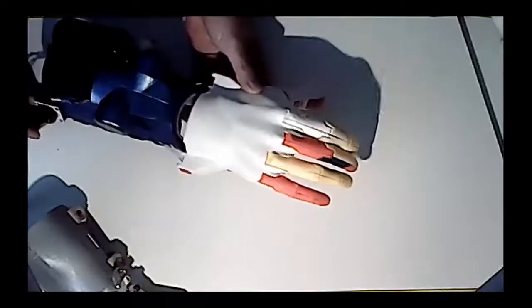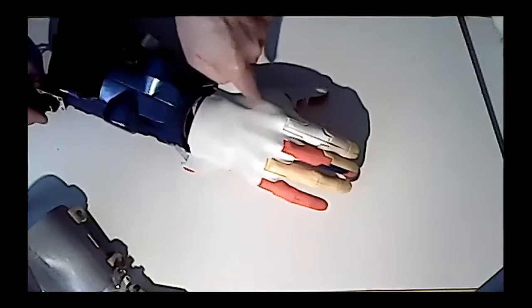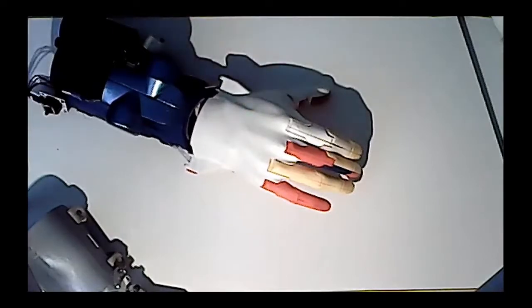So here we try to be better than the myoelectric sensors. Somebody has a very good idea to insert here a micro joystick. The micro joystick you may have in a PlayStation or in a handle, and Natalie is moving the micro joystick with the muscle of the thumb. So in theory, it worked great. In the design lab, it works great as well. But when Natalie inserts her palm into the hand, the muscle was not exactly where the sensor was. And it was very difficult to adjust it.